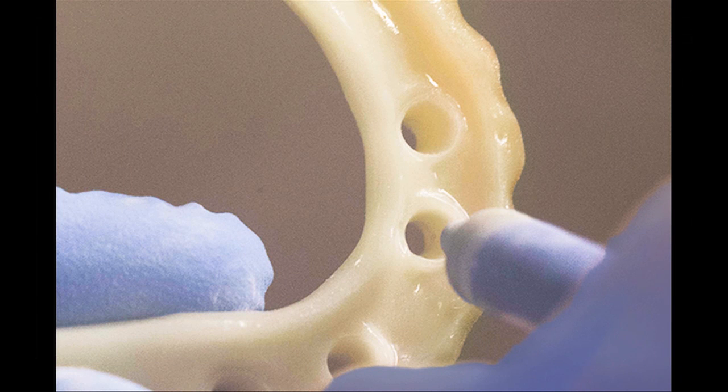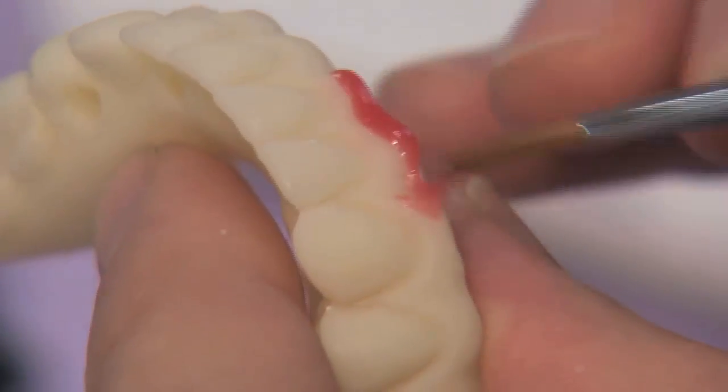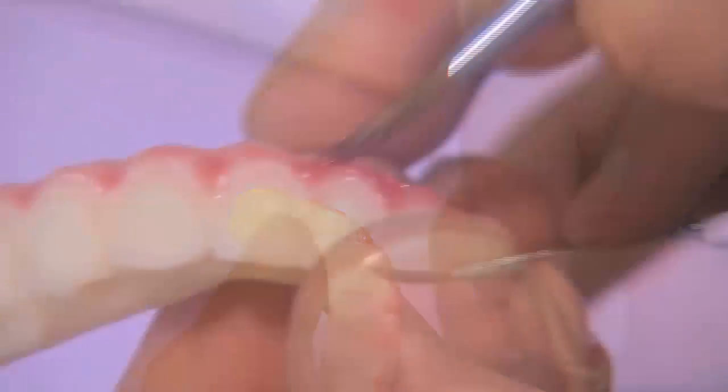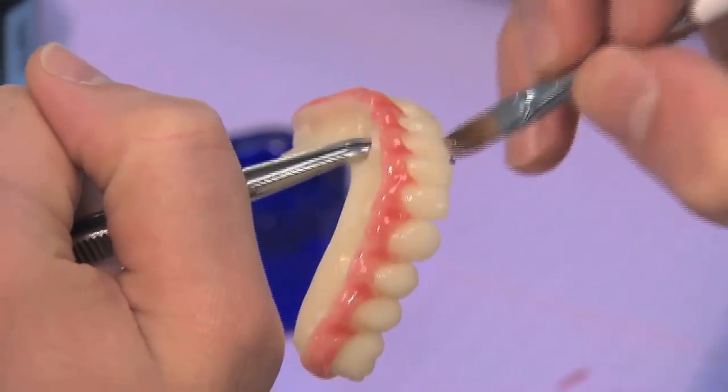Next, the provisional prosthesis is sandblasted in preparation for staining. It is then steam cleaned to ensure a particulate-free and sanitary surface prior to staining. Lastly, stain is applied to the gingival areas and glaze is applied to the entire surface of the provisional prosthesis to give a more natural-looking appearance during patient confirmation of the definitive design.